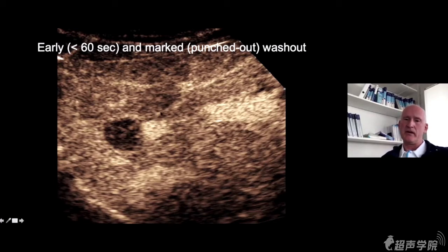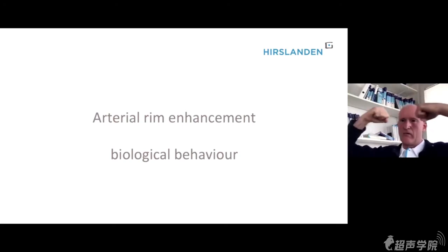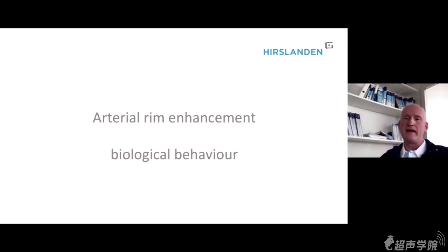Nicely in comparison to the hepatic artery in the arterial phase and portal vein in the portal venous phase. We have that biological behavior of different lesions, and if you have an aggressive lesion which is round, voluminous, it is aggressive at its circumference, rim enhancement.